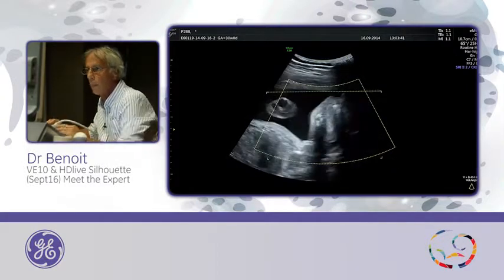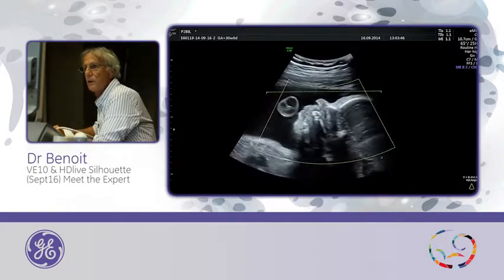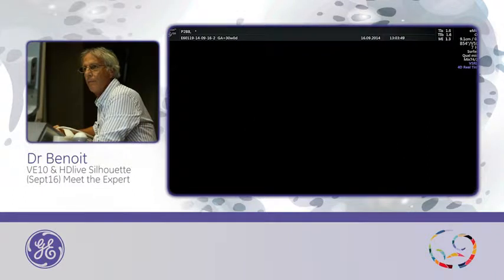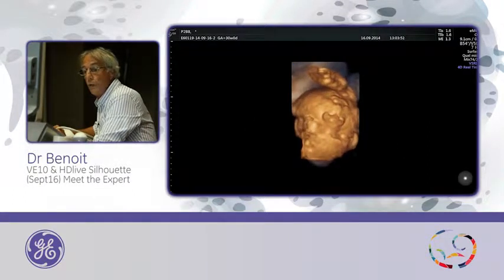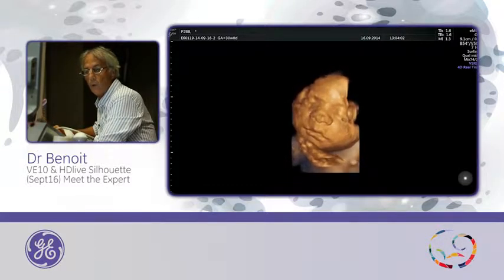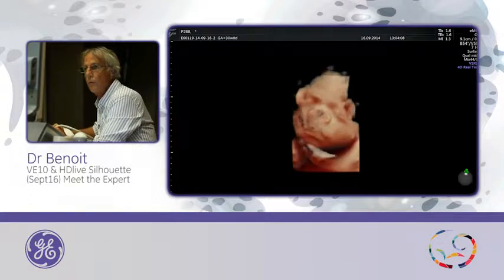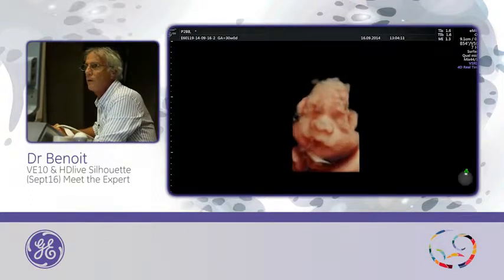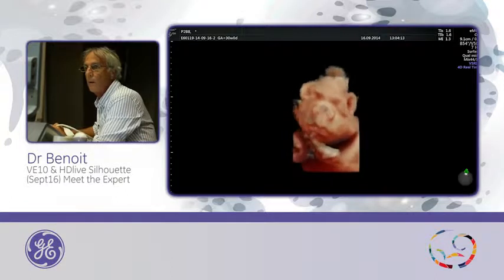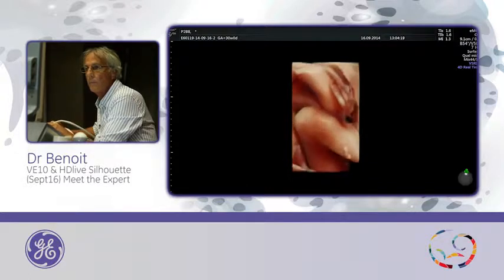So I will do it 4D, face. I need my foot switch. Yes. Okay. Good. I need to invert, and I need to go to sub-render. No, to go back to main render, to HD Life, and you will take the first one, this one. So this is 4D, and we are now at 7 frames volume per second.